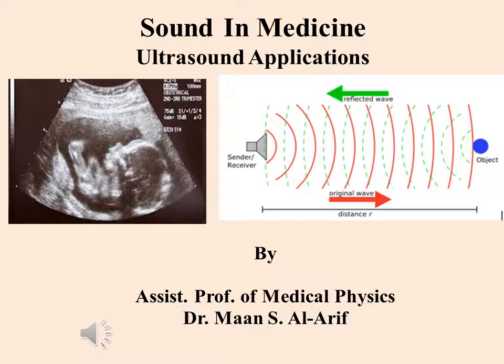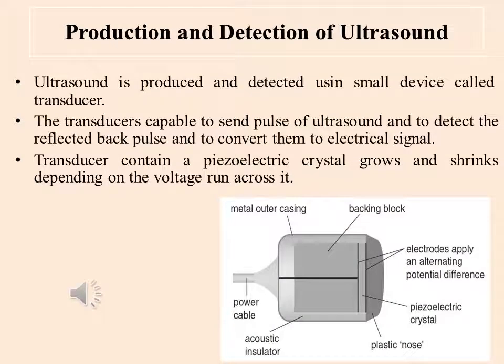Sound in Medicine. Ultrasound Applications. By Assistant Professor of Medical Physics, Dr. Al-Arif. Production and detection of ultrasound. Ultrasound is produced and detected using a small device called a transducer.